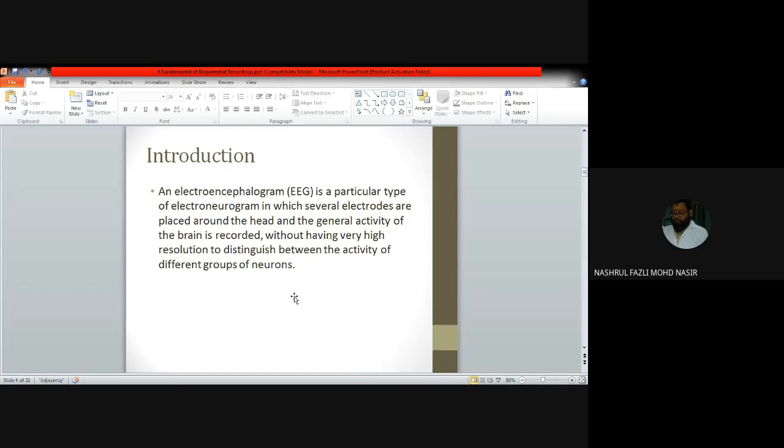So the setup doesn't have to have a high resolution. Although all this statement is true, our EEG is, I think, about 180K in our lab. 180K at that time; this time I think it's much more. It was that much.